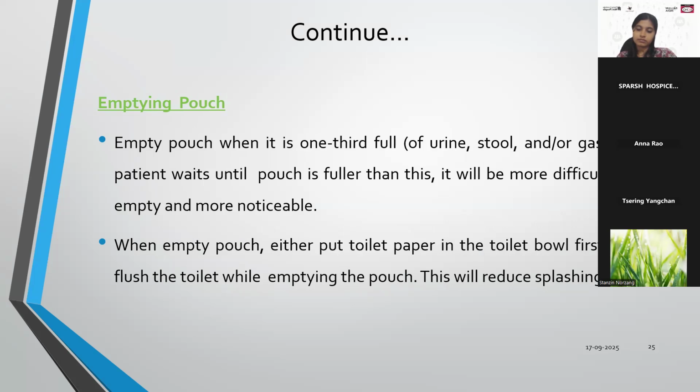So this also I told, once it is 1/3 full, it should be changed. For different purposes, the stoma bag may be applied. It can be for urine also or stool. So for different procedures, whatever is there, one has to remember and tell so to the relatives.